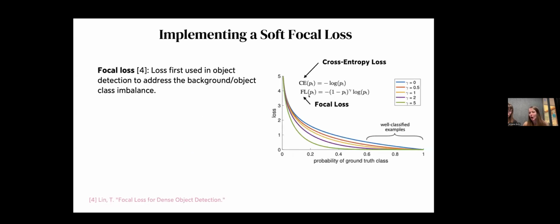The main challenge of training our model was the loss to use. If we go back to what Arijana told you, we have a highly imbalanced data set because we have a low amount of lesions in the whole slide images. So that's the first way this data set is imbalanced: we have more patches without lesions than patches with lesions. But there's another way this data set is imbalanced. Among all our patches, we have a lot more patches which are only slightly overlapping the lesions than patches which are centered on the lesions. Indeed, if we have a look at our data sets, the mean IOU of our patches with lesions would be around 0.1 or 0.2. So this means that our data set is highly unbalanced.